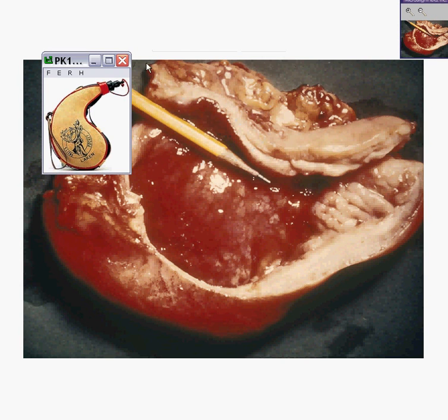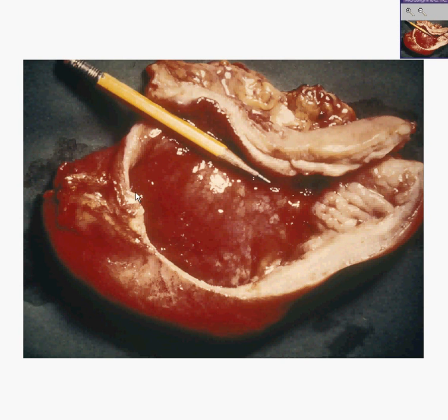It's so diffuse and poorly differentiated, it just diffusely thickens the entire wall of the stomach. Sometimes there's not even much of a lumen left. And whereas yes, it's a poorly differentiated adenocarcinoma, the bulk of the tumor consists of poorly differentiated, perhaps abortive glands or signet ring cells, diffusely throughout all three layers of the stomach wall.